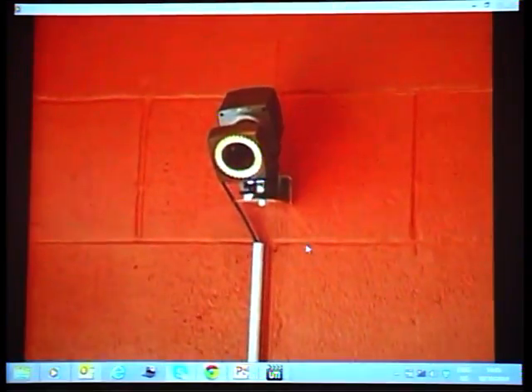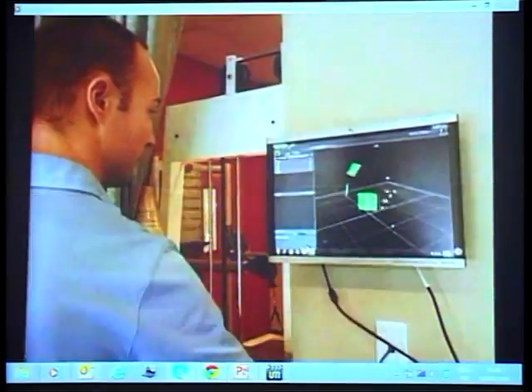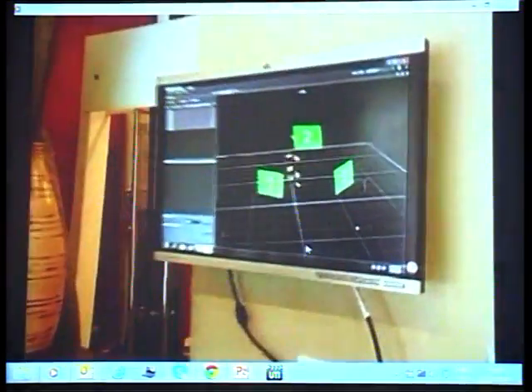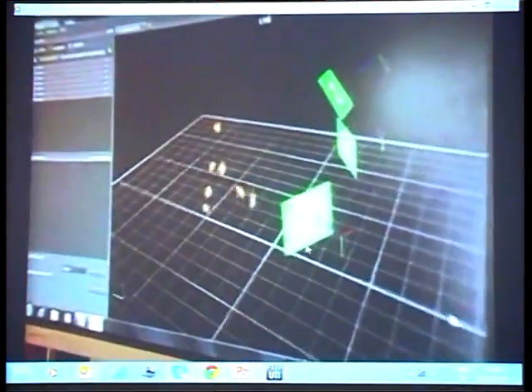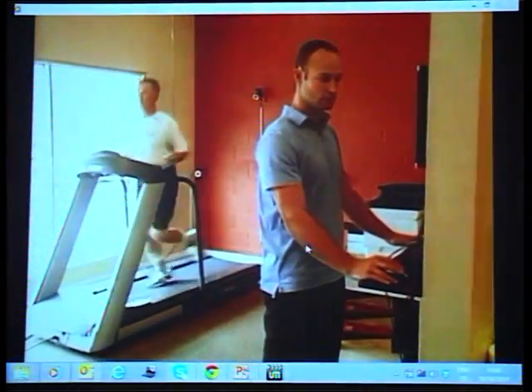The cameras that we're setting up here are actually going to look at exactly how your foot, your knee, and your hip move. And that might give us a lot of clues as to why that particular knee injury is there. The technology is used in only 5 cities in North America. And according to these guys, it takes a lot of the guesswork out of diagnosing the problem.